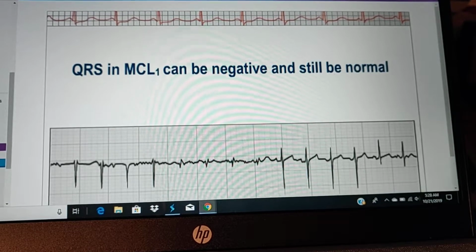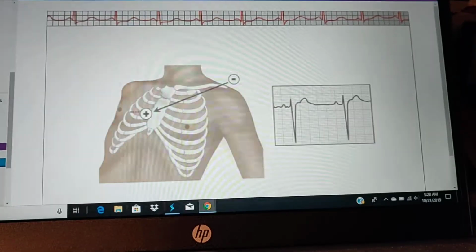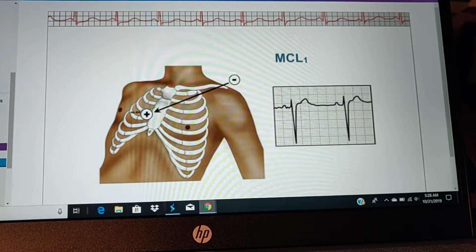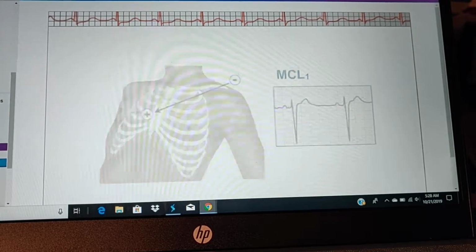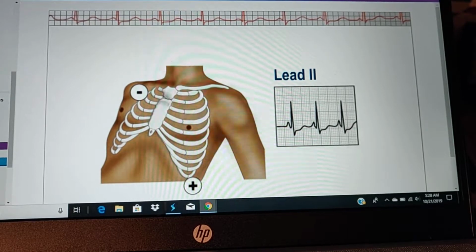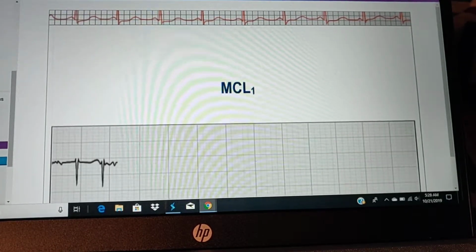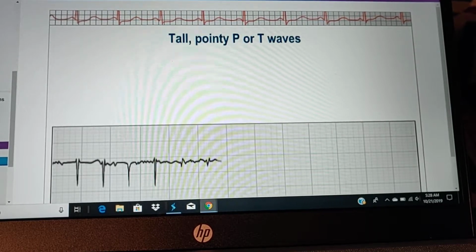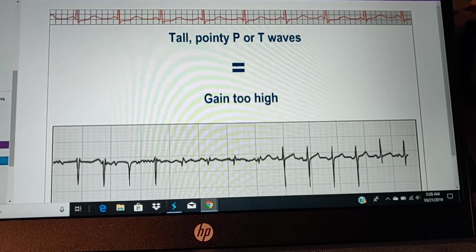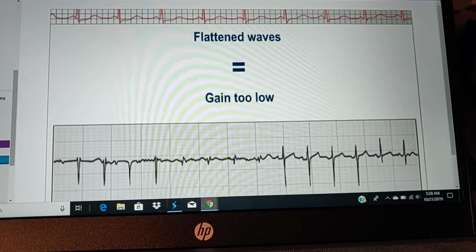Remember, lead views need to be chosen to reflect the need. If a patient has an anterior MI, you would want to look at the modified chest lead. If the patient had an inferior wall MI, then you would want to use lead 2. Also, be sure your gain is adjusted properly. Tall, pointy P or T waves could mean the gain is too high. Narrow, flattened waves could be a result of a gain set too low.